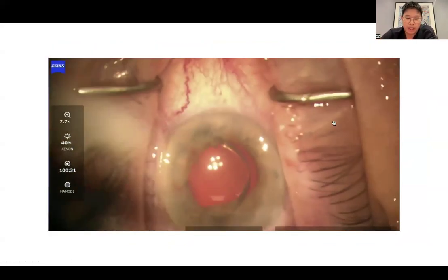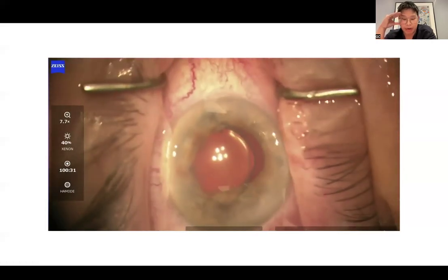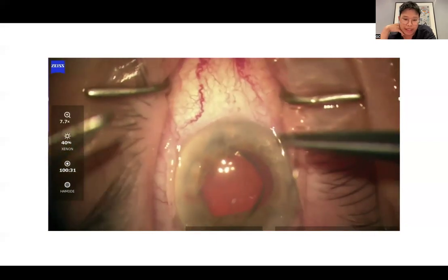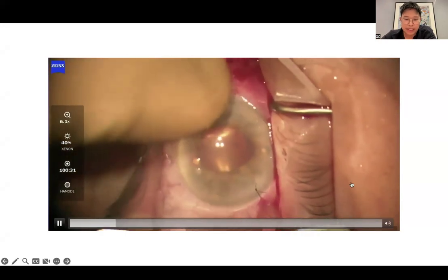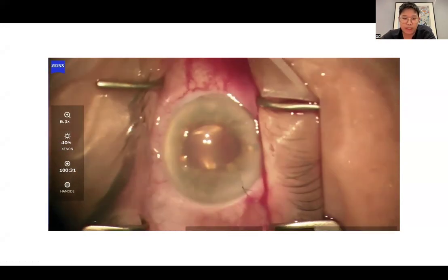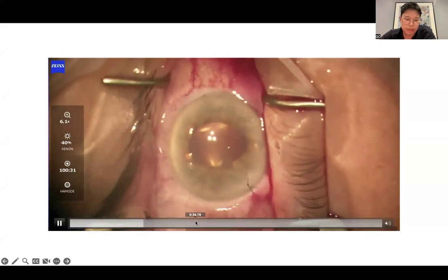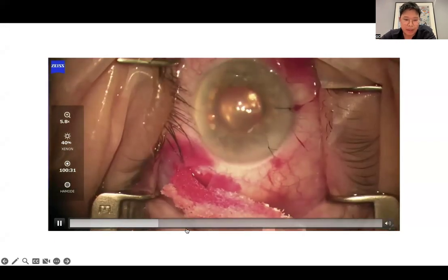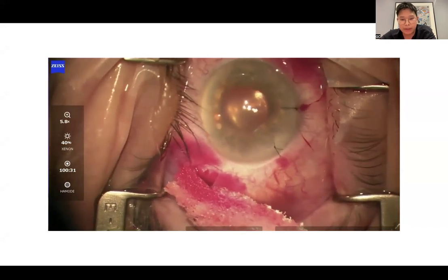And so, here's a case of intraoperative aqueous misdirection. You can see the iris prolapse and the very flat anterior chamber. Here it happened at the end of the surgery, and so a sub-Tenon's anesthetic is done. The eye is rock hard here, and you can see the cornea is starting to haze up. So what we'd typically do is a limited vitrectomy, and basically with an MVR stab, you can use your vitrector.